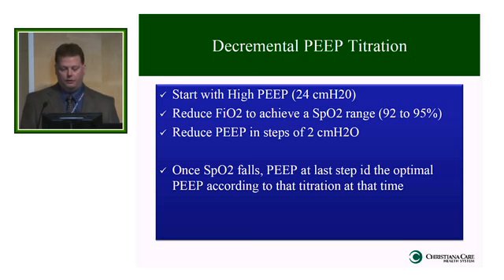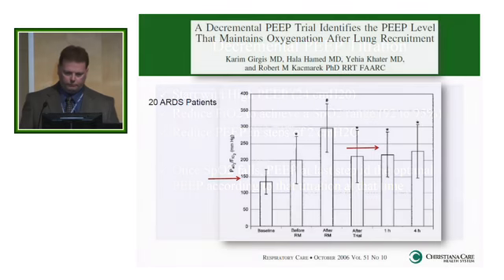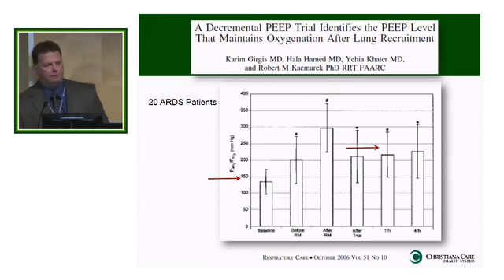Probably the kind of thing we should do at bedside more than just tweaking the PEEP up. So what have people seen when they've done decremental PEEP trials? This is from Respiratory Care Journal in October of 2006. Again, these things are probably not showing up that great here. It looks like not too bad.